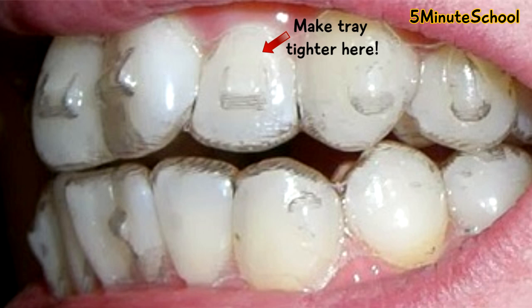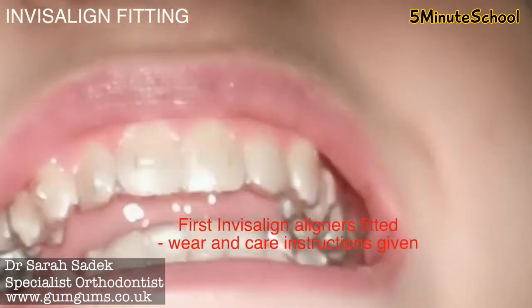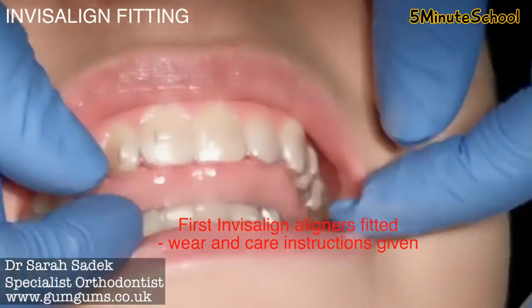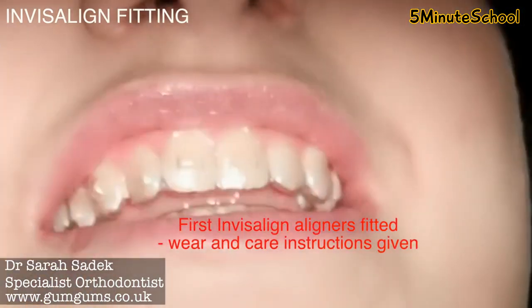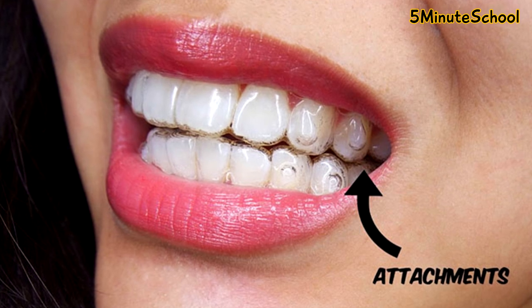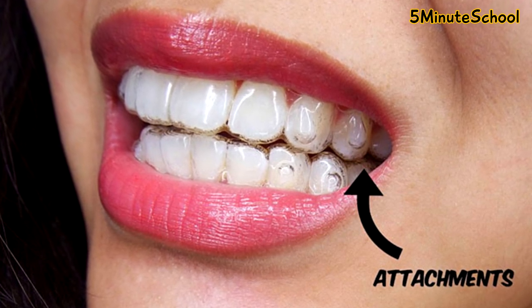If we keep doing this for your next few trays and make it slightly tighter every time in this area, over time we'll start to see the tooth shift in position and eventually move down to the point where it's aligned with the teeth next door. That's basically the principle of how these attachments work. And although you wanted to be discreet with your orthodontic treatment, Invisalign attachments — although it may sound like they make your treatment more obvious — because these attachments are tooth-colored, it's often still very difficult to see them.